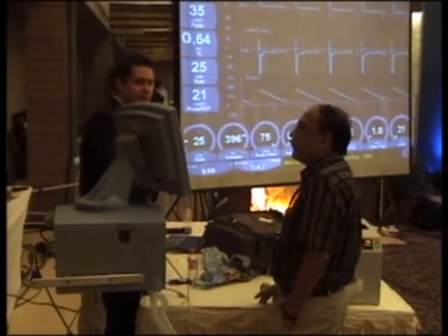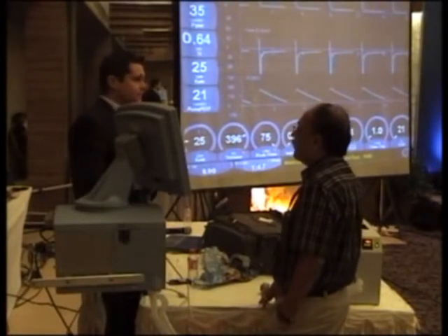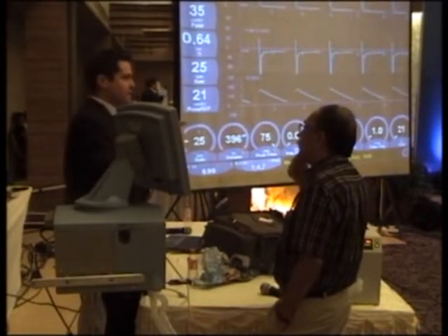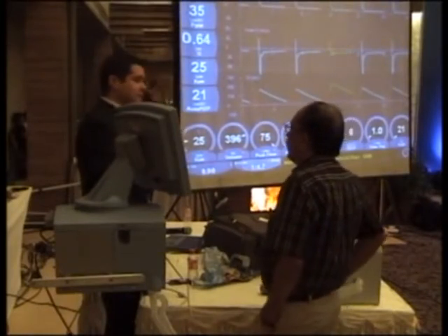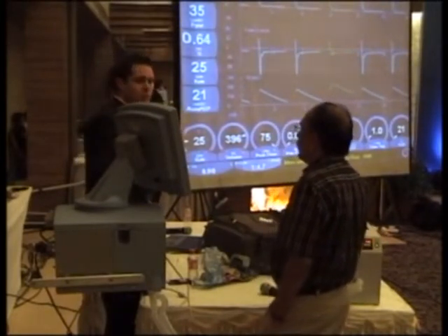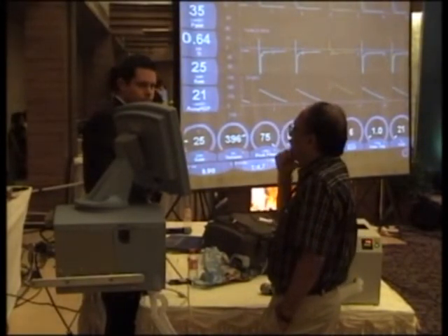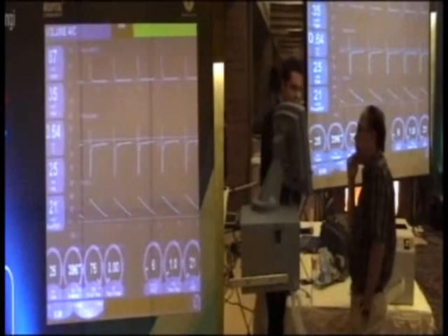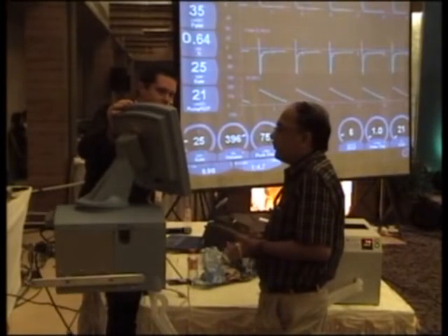We still have gas trapping based on our flow time scalar. Blood gases come back with the CO2 in the 50s, pH is around 7.30. What is our next step? The bronchodilator clearly didn't work in this particular patient. All right, we need to get this kid steroids as soon as possible. So what would we do at this point? Yeah, so we can't really manipulate the inspiratory time any longer, so what would we manipulate? Reduce the rate. Okay, so you're going to reduce the respiratory rate.